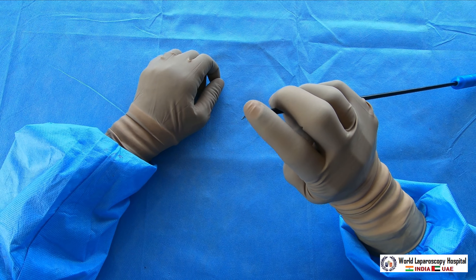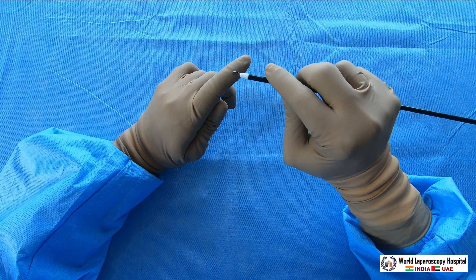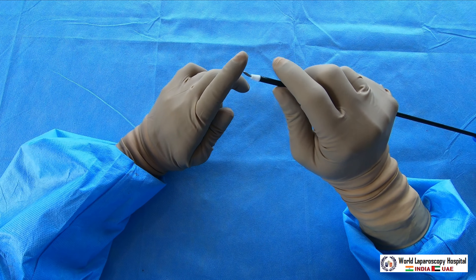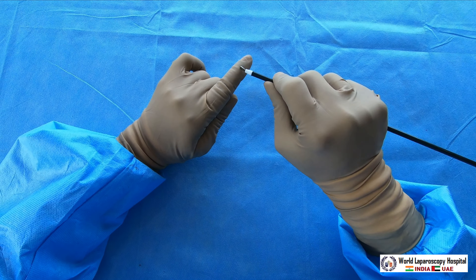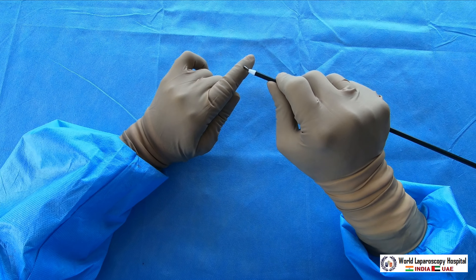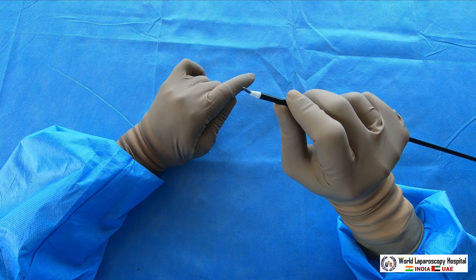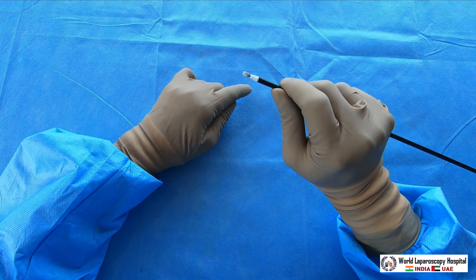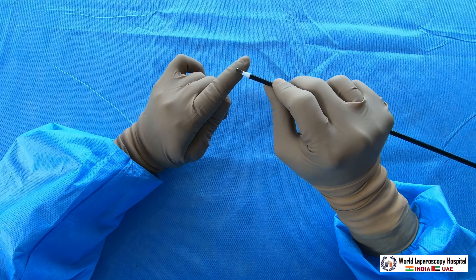The tip of the spatula is used by some surgeons for cutting the shoulders of the gallbladder, and also used by gynecologists to do colpotomy. The tip of the spatula can cut as well. Instead of a hook, some gynecologists use the spatula for cutting, and the back of the spatula for stopping bleeders — that is for fulguration.